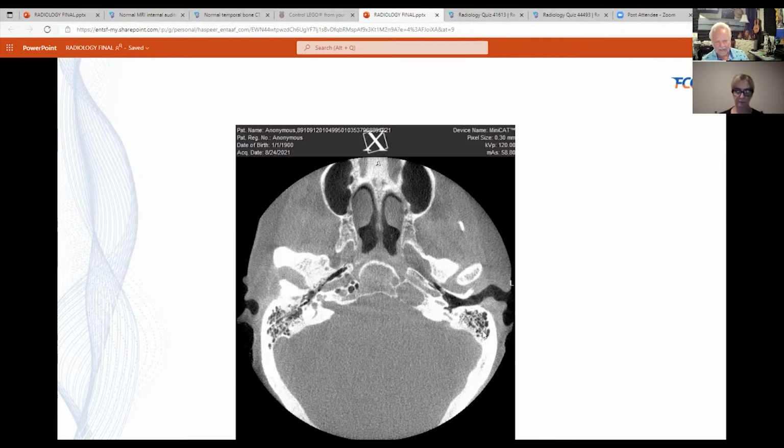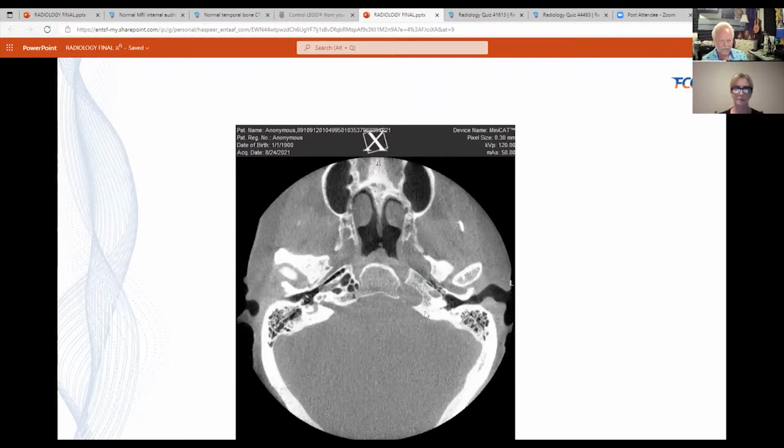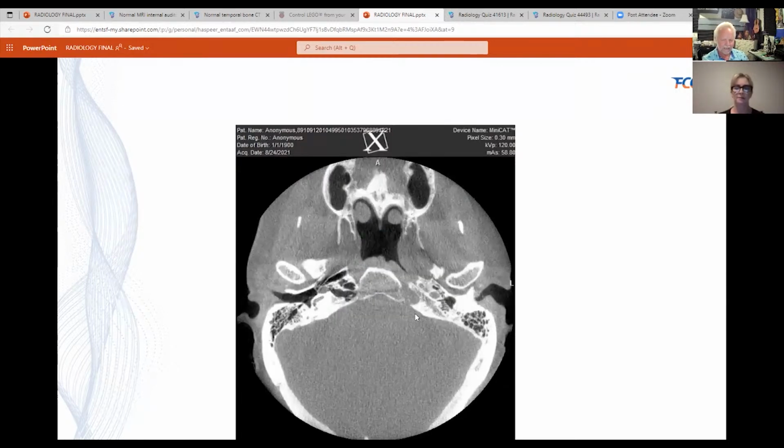deep can be tricky. Often we will try to go through the mastoid and work our way out this way, but it's a long haul. And interestingly, on this study, it might have an approach through the nose, because there's a very thin septum right here between the back of the nose and this cyst. So that might be another way of getting through it. And you can even see here where it almost looks like maybe it came from the nose. Most of these are otologic, but in this particular case, I thought maybe that this somehow had its origins extending out of the nasal cavity.